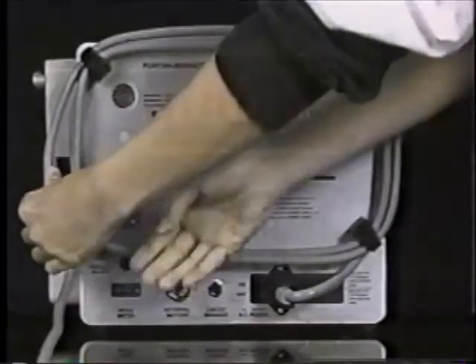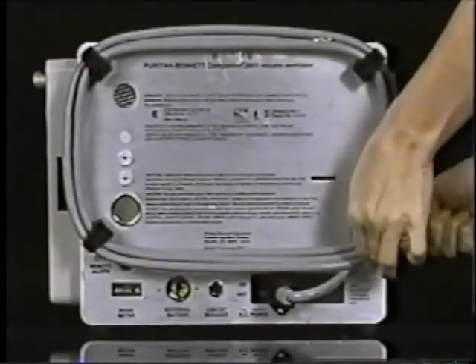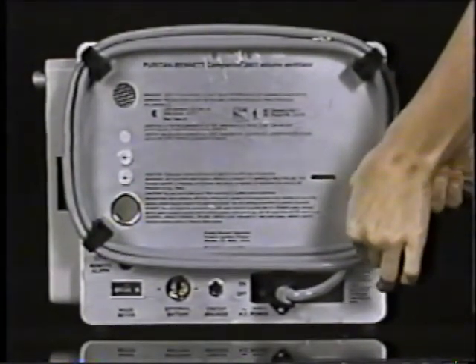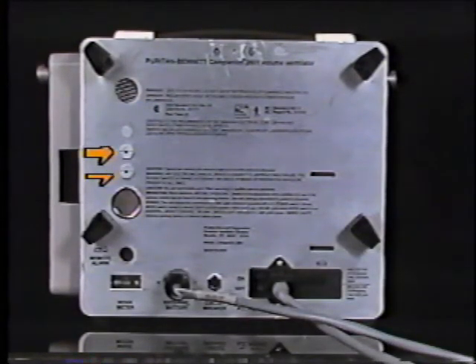4 brackets on the back serve as a cord wrap and as a means of support when the ventilator is operating on the rear panel. These ports function as ventilation for the internal cabinet, for reference of atmospheric pressure, to vent the exhalation diaphragm valve, and to vent excess pressure when the pressure limit control is being used.